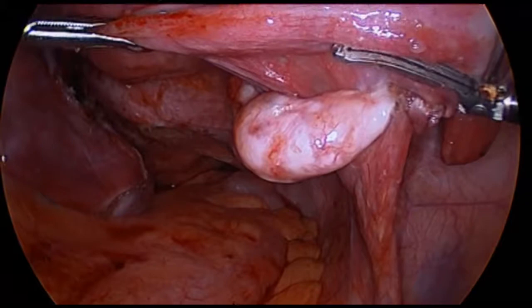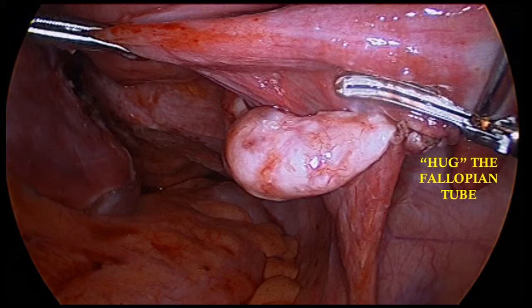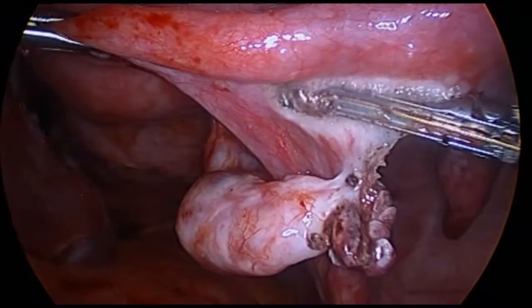The area of dissection is then inspected for hemostasis. In certain situations, the vessel sealer is used through the lateral port when beginning the dissection at the fimbriated end. This optimizes tissue exposure and presentation. Care must be taken to identify the location of the IP ligament to avoid inadvertent injury to those vessels. Dissection then proceeds medially, taking care to hug the fallopian tube and avoid large mesosalpingeal vessels. In this case, the assistant is crucial in maintaining ideal tissue presentation.